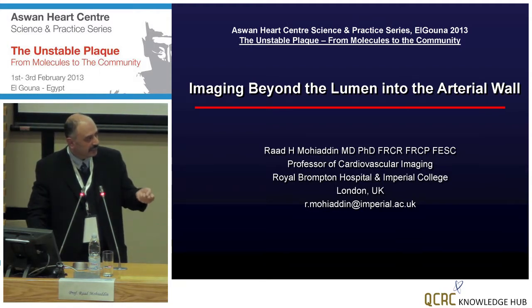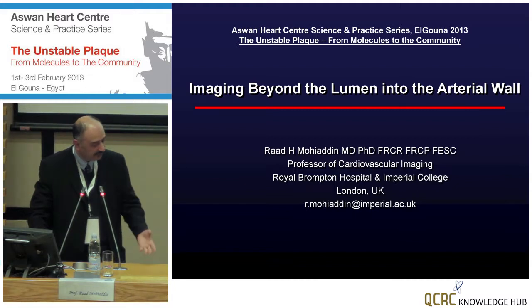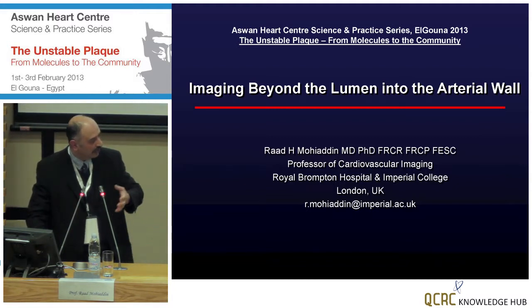The problem with 3 Tesla or high field in general is that you get higher signal, but you create other problems because you get a lot of artifacts. It's not easy. So it is not as simple as high field equating to high signal, equating to high resolution.